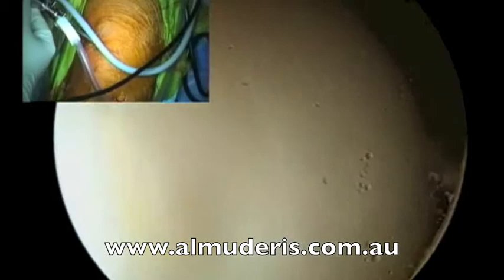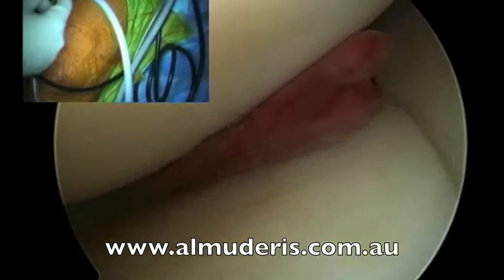This is the patella. It seems to be fine. The trochlea of the femur seems to be fine as well. We move to the medial compartment of the knee.